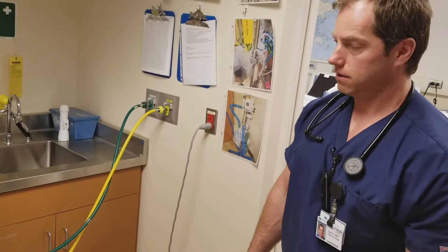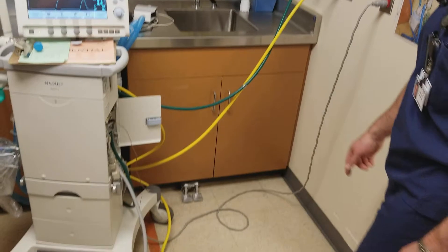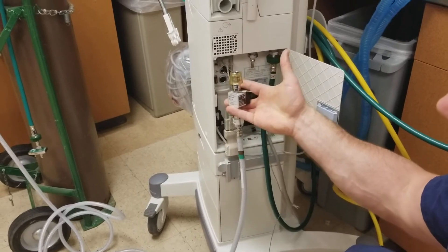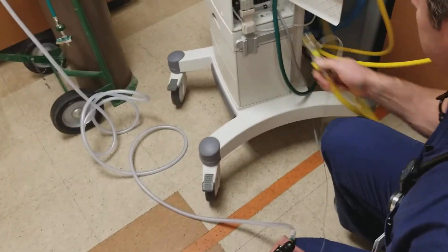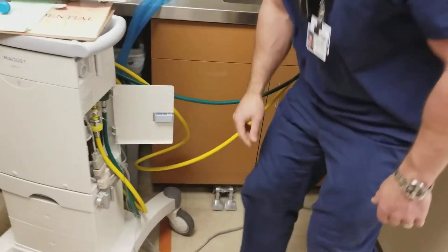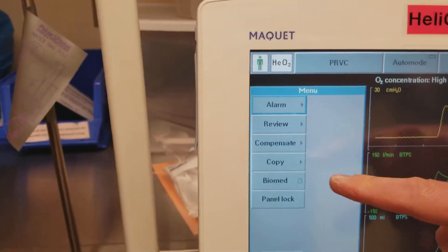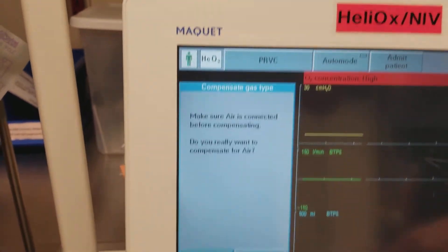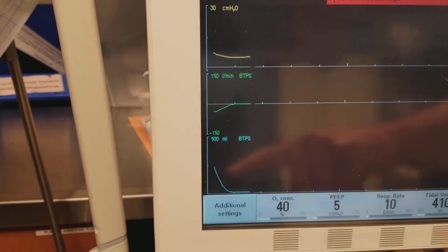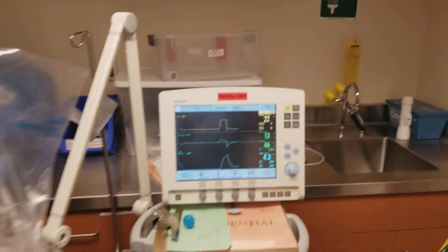To switch back to air, all we have to do is reverse our process. Come down here, disconnect the helium just like we did the air, then push the air back on. Now we need to tell the ventilator that we're running air instead of helium. Go to menu again, Compensate, gas type, and it says make sure air is connected before compensating — it is — so we say yes. The indicator that previously showed helium is now gone, so we're running straight air instead of helium.